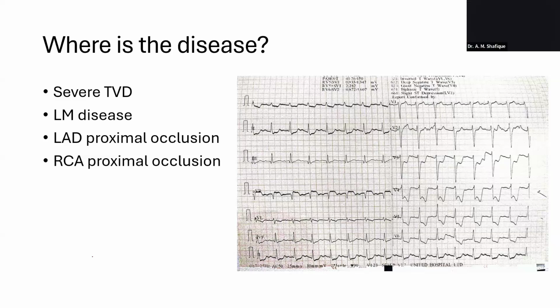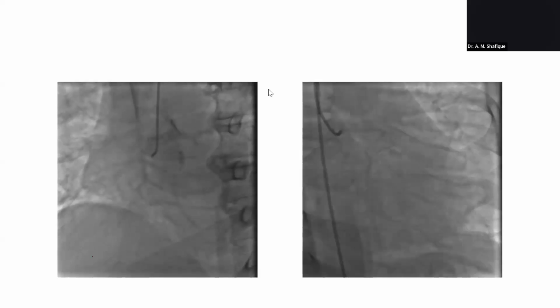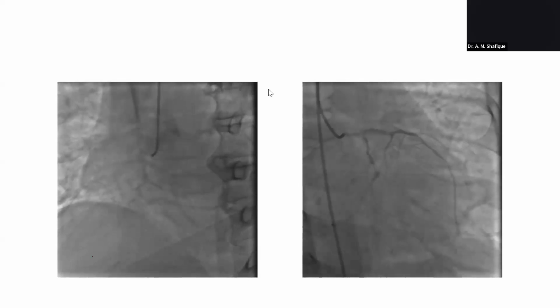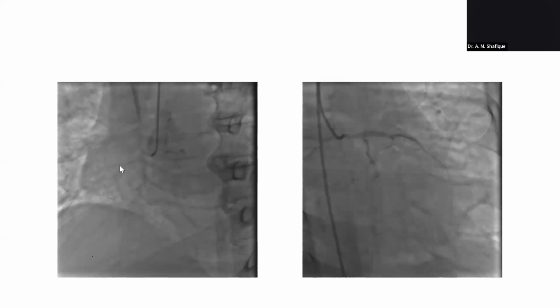Right, sir. The patient's blood pressure was not there, severe. The patient was in shock. Definitely. We could not get the RCA ostium, but we don't want to lose time, as we know the RCA was seen a bit. That is why we did not go to the RCA to see the total RCA, as the patient is on ventilator and time is short. So we had already decided the patient should have left main disease.